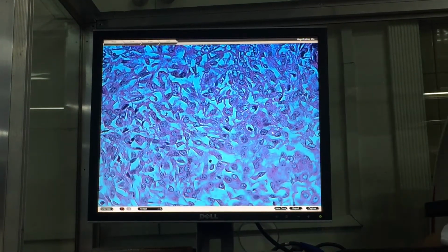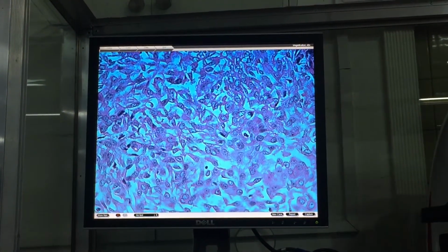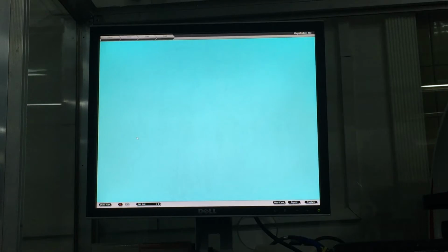This is already very large nuclei. So pleomorphism. This is your high-grade urothelial carcinoma. The papillary ones that you see earlier are features of low-grade urothelial carcinoma. Next is nodular hyperplasia of the prostate.